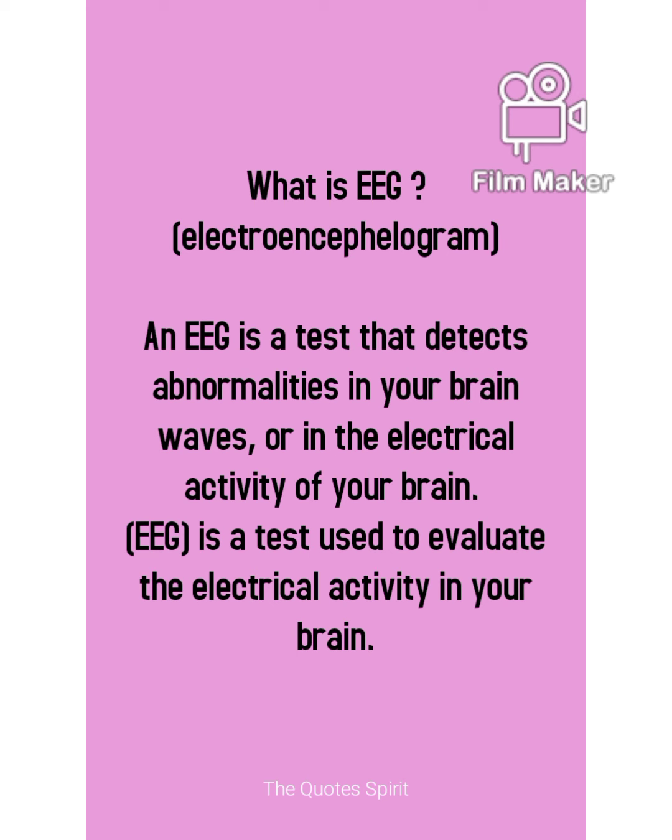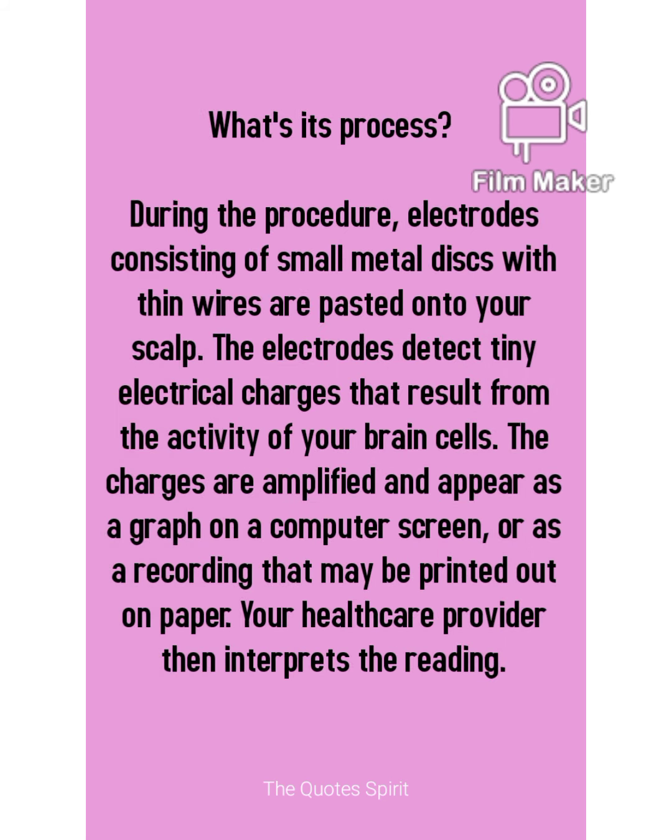EEG is the short form of electroencephalogram, and EEG is a test that detects abnormalities in your brain waves or in the electrical activity of your brain. The EEG is a record of the slowly changing electrical activity of millions of nerve cells all functioning at the same time in the brain.